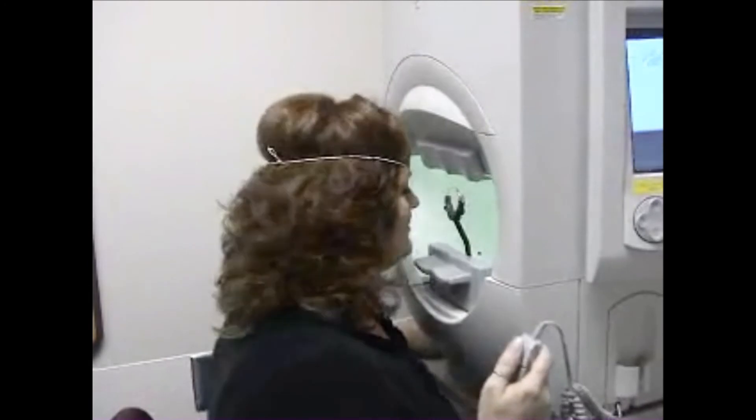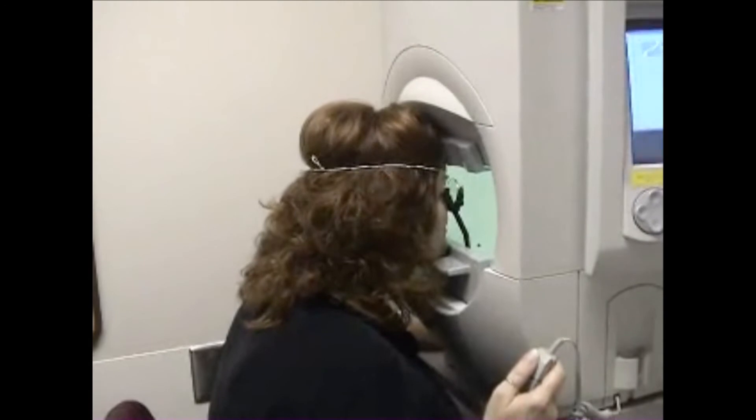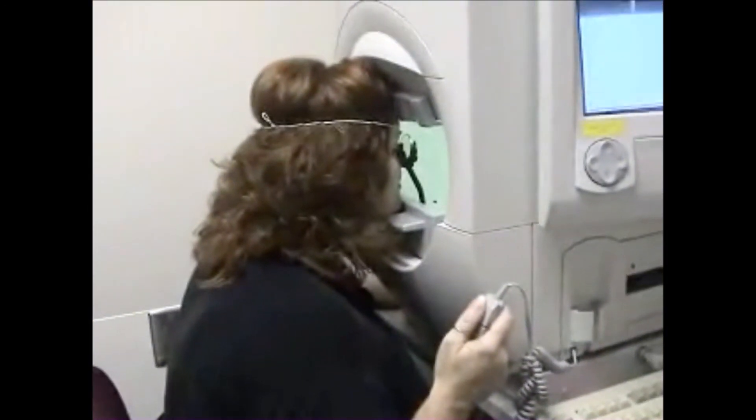The patient's head was placed in a white bowl perimeter with an appropriate lens correction for viewing at one-third meter. The patient was instructed to maintain fixation on a central area and to press a buzzer when he or she detected a white dot briefly displayed somewhere on the bowl.